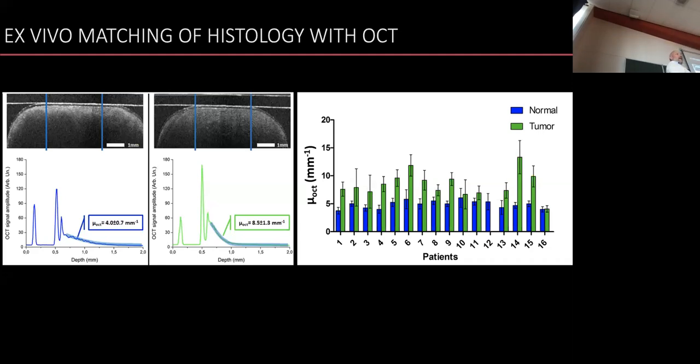But you have to know what it is. So you either take a biopsy, like I said, or you have a tool like OCT that you can bring in there and differentiate between benign and malignant tissue, and you have your answer right away.